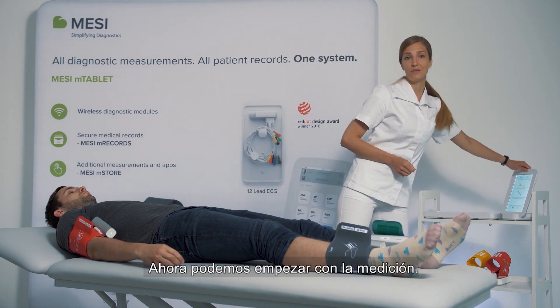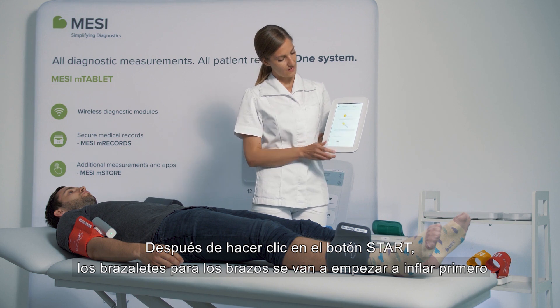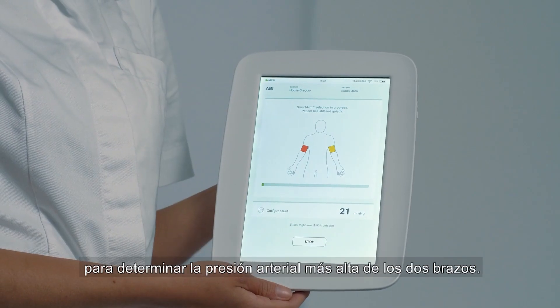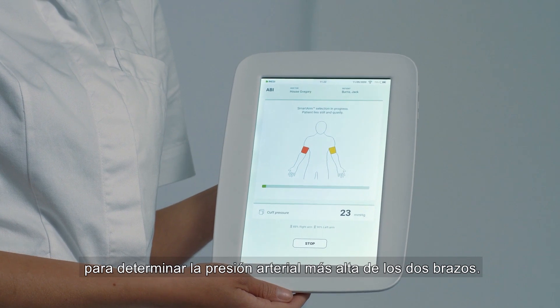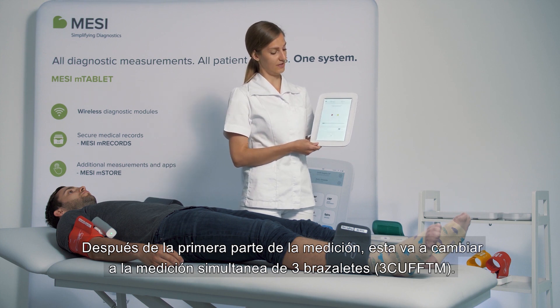Now we can start the measurement. After pressing the start button, the arm cuffs will start inflating first to determine the higher of the two arm blood pressures. After this first part of the measurement, the measurement will jump straight into a three cuffs simultaneous inflation.